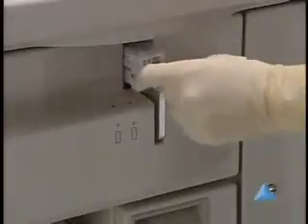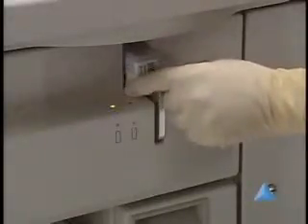To load an ancillary pack, place the ancillary pack in the ancillary reagent queue with the barcode label facing outward. An LED next to the ancillary reagent entry turns green to indicate that the pack will be loaded. The system will then move the pack into the ancillary reagent compartment.